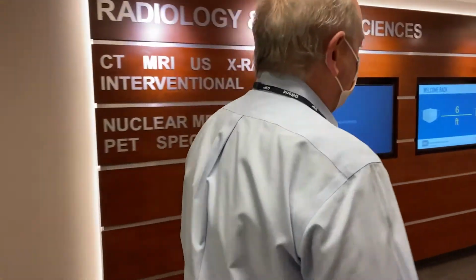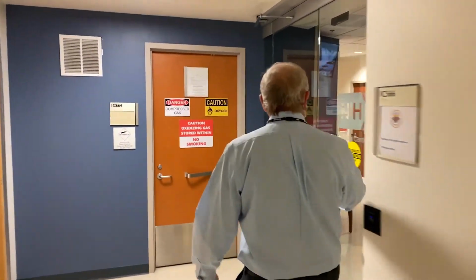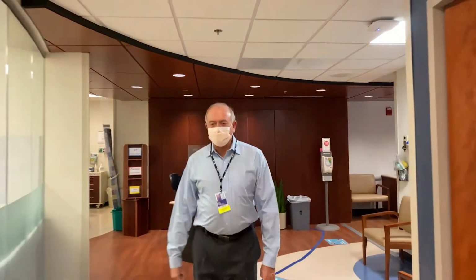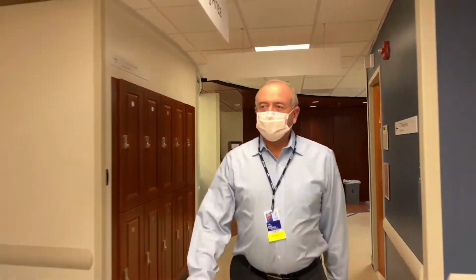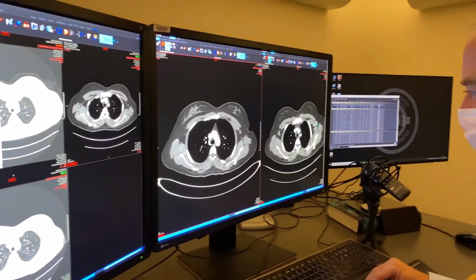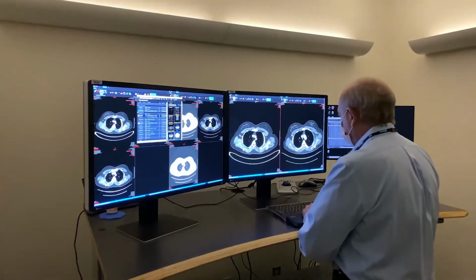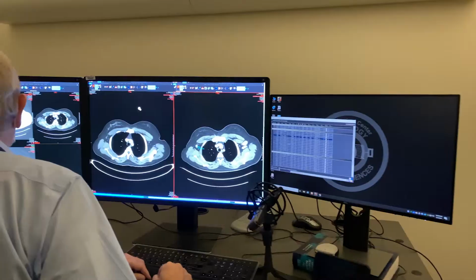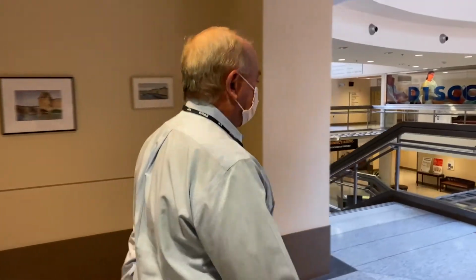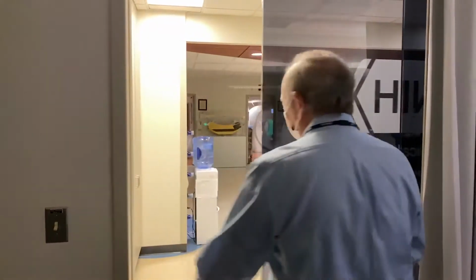Dr. Folio is a senior research physician and the lead computed tomography radiologist at NIH Clinical Center. He will provide an overview of our Radiology Preprocessing (RP) integrated workflow curriculum that includes image acquisition such as computed tomography or CT and PACS, otherwise known as Picture Archiving and Communication Systems. PACS is used to view medical images and includes highly advanced processing tools that produce multiplanar reformation, 3D imaging, and lesion management applications. And now we'll walk into the CT consult area.